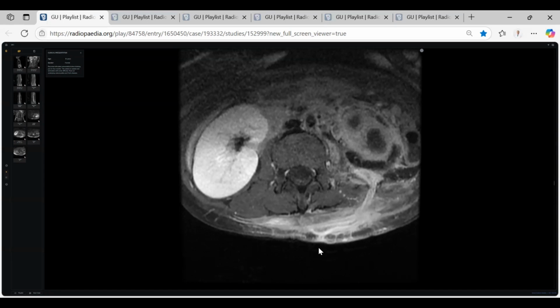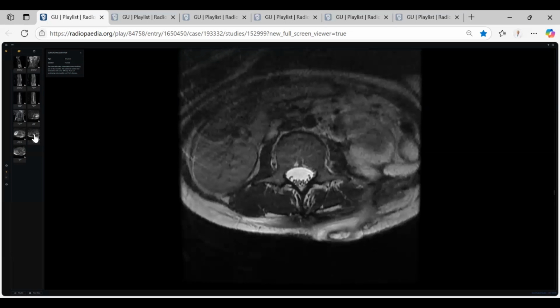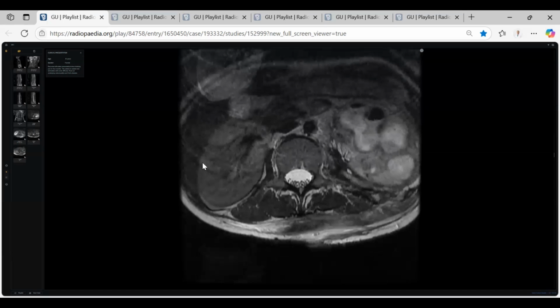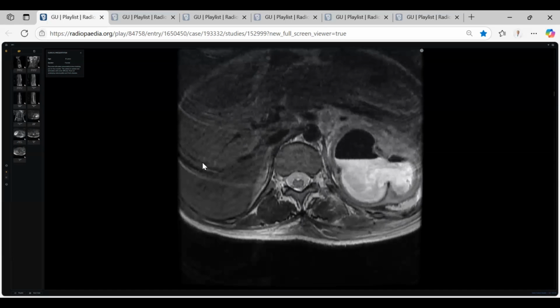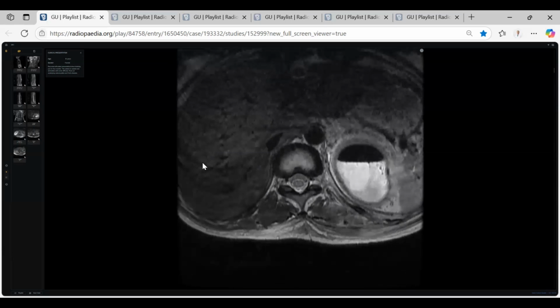Tell the skin. So this is a nephrocutaneous fistula. Excellent. Give me your final diagnosis, please. So it's a significant infection, emphysematous pyelonephritis with rupture of the abscess causing nephrocutaneous fistula. Thank you, doctor, so much.